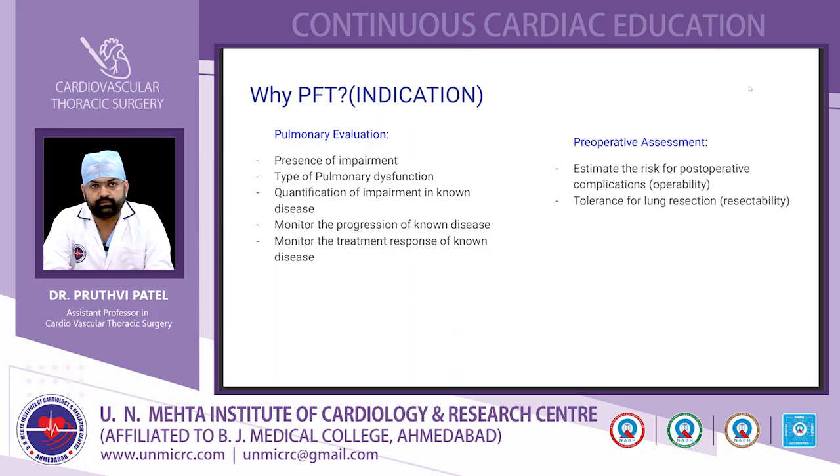So, indications for PFT: why do we do PFT? We do it to evaluate the presence of pulmonary impairment, the type of pulmonary dysfunction, quantification of impairment in known disease, monitor the progression of known disease, monitor the treatment response of known disease, and as a preoperative assessment to assess the risk of post-operative complications and operability of the surgery, or for lung cases, tolerance for lung resection and resectability.